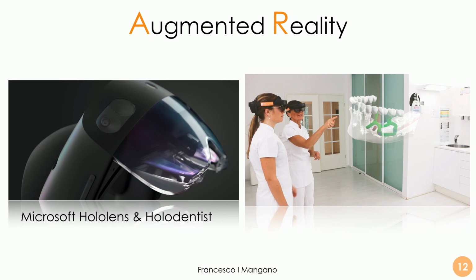This is a beautiful tool, augmented reality, to communicate between colleagues and with the dental technician, because we can see a gigantic 3D model of our patient in the middle of the room, and we can discuss eventually treatment, procedure, protocol. Also, we can explain to the patient what kind of treatment we are planning to do, and that will help, of course, to increase the compliance of the patient, and the patient can accept the therapy easily because it's very visual and very immediate and very fascinating.